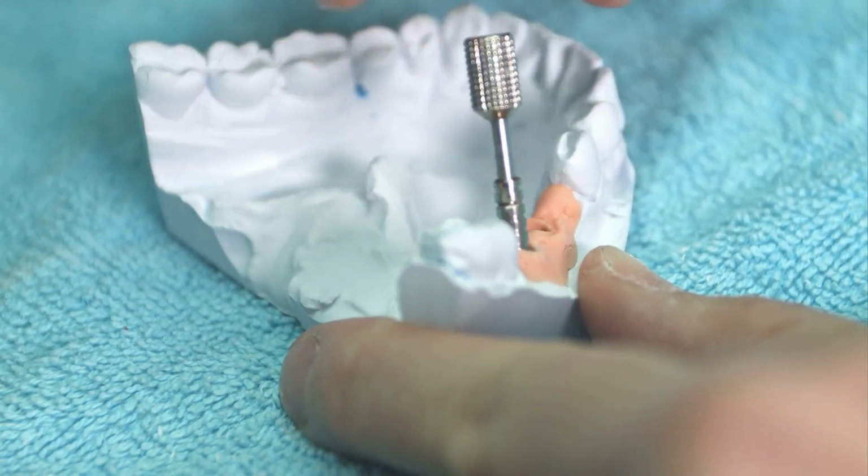Then using software called exocad, and there are some other ones, we can take that and duplicate the other tooth if we like that, or make changes in this software and tweak it. You can look at it if you'd like, or maybe you do that further for the final. But the point is that when the implant goes in, we scan it, print it out, and then we can just go ahead and screw the tooth in. Again, this scenario is describing a front tooth, not a back chewing tooth. That's a little bit different, and I don't want to go into the biology behind implants in this video. I have other videos that talk about that. But you can see how that would be a benefit.